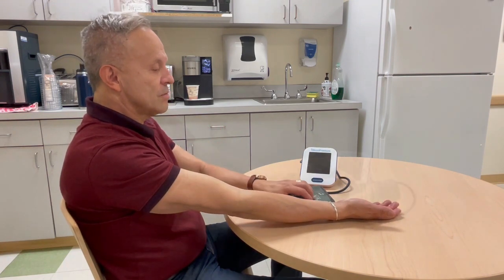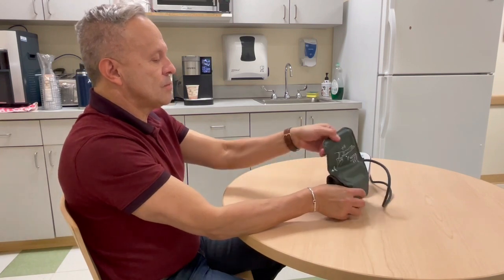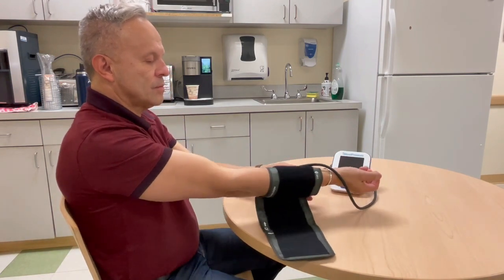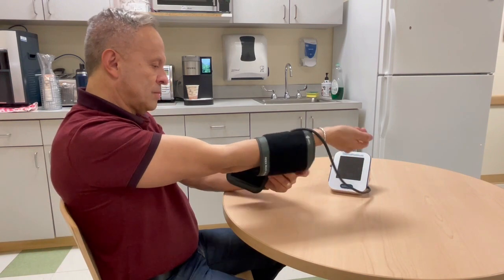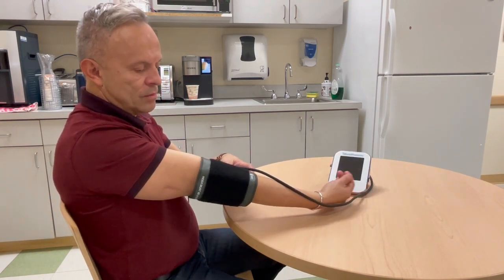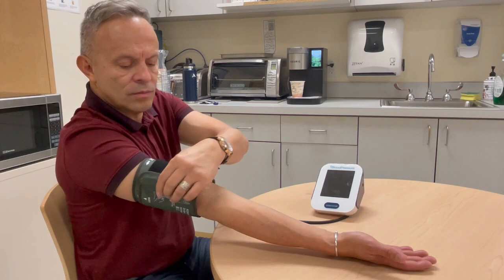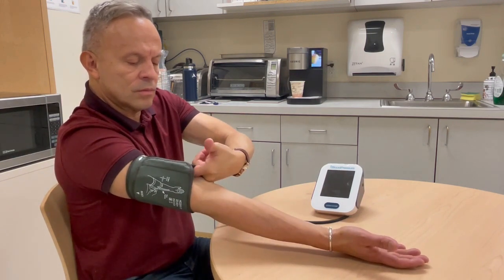Take the cuff and slide it over your elbow so that it sits directly above the bend in your arm. It is important that the picture of the arm on the cuff matches the direction of your arm, or you can read the instructions on the cuff. Rotate the cuff so the tubing falls at your inner arm. Tighten the cuff until it fits evenly and snug. You should be able to fit just one finger between the cuff and your arm.